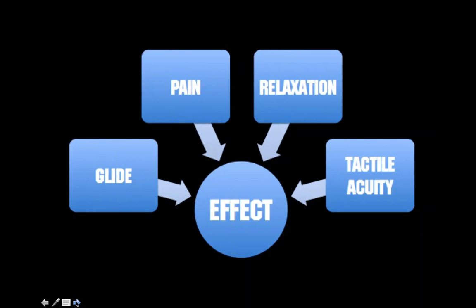As far as effects, mitigation of pain, of course, is a big one. Causing relaxation, not just to that tissue, but the nervous system. Increasing some tactile acuity, like I spoke about earlier. Patients that have knee pain and or low back pain chronically may lack some tactile awareness and tactile acuity in that area, believe it or not. So less is more. You can always go harder. We just suggest that you try a little bit lighter to see if you get some outcomes along with some education.